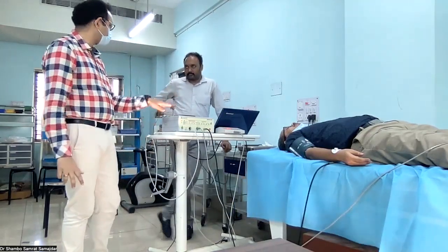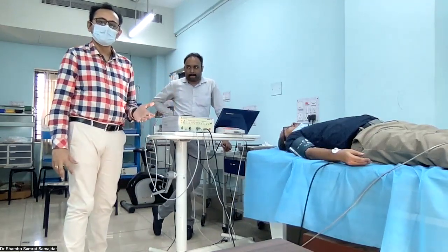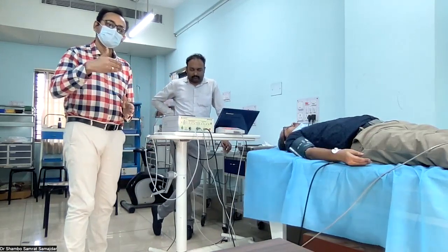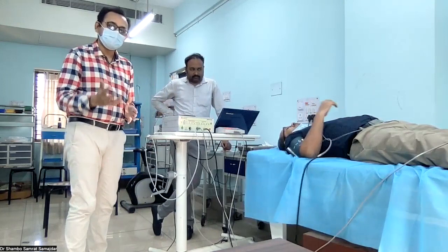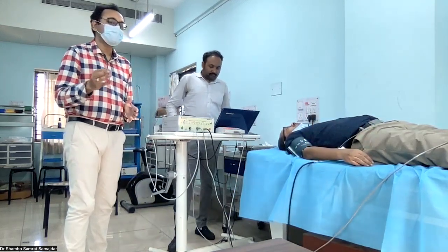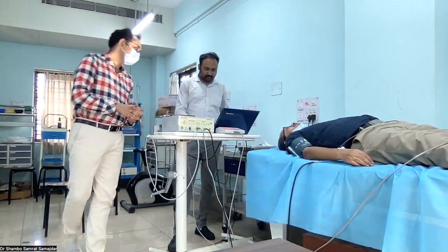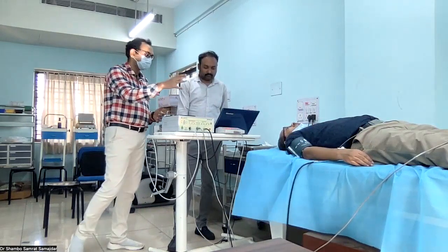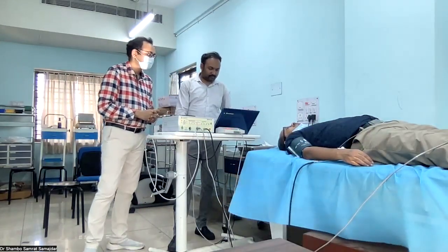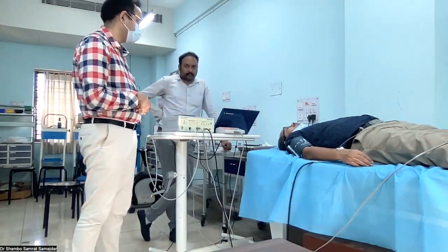We all know by definition, when we are talking about orthostatic hypotension, we need to check post standing 3 minutes, 3 minutes after standing. So that report we can do manually. Okay, so let's start. So first we are checking the blood pressure in the supine position.